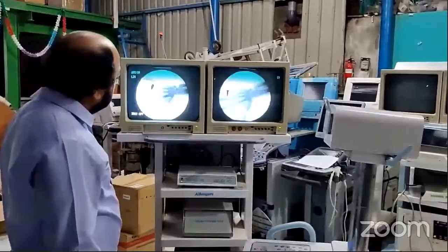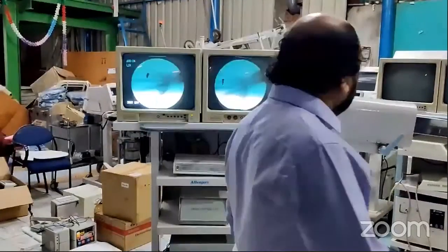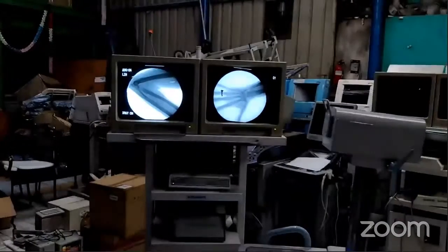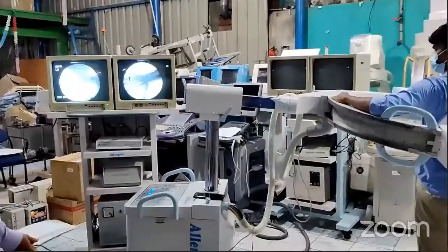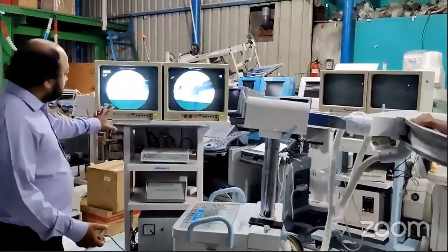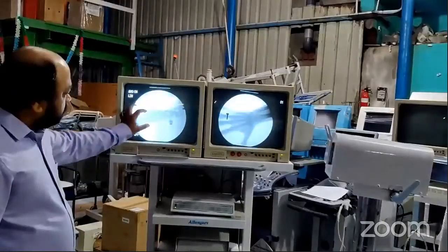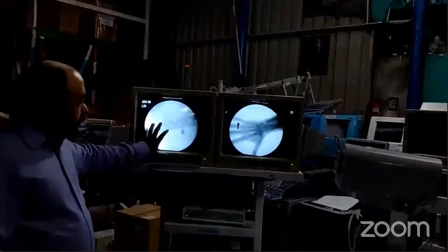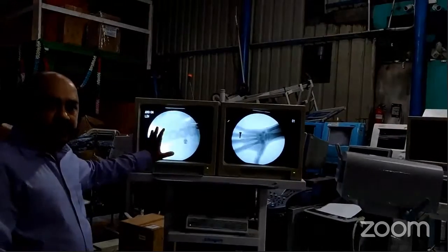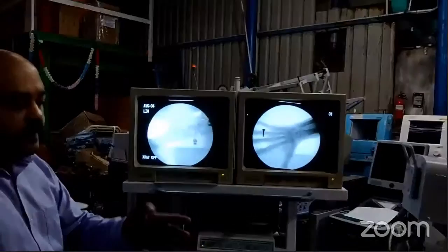So like that you can expose a hand, or you can take some arm. Spine. Okay, this is the spine of the patient. So here you can see all the L2, L3 like that. The doctor will know all that. I'm just showing how to take the spine and how to take the hand and the imaging.